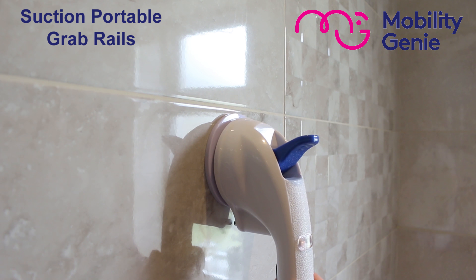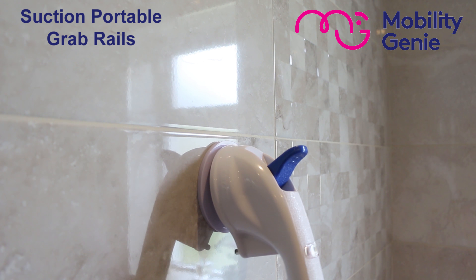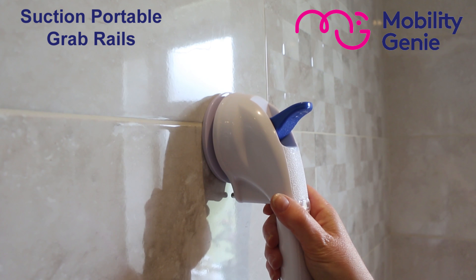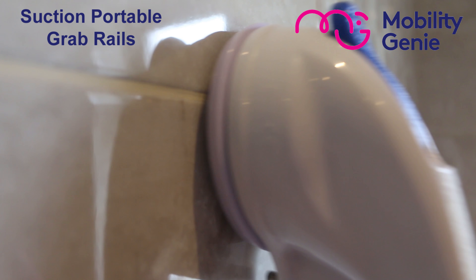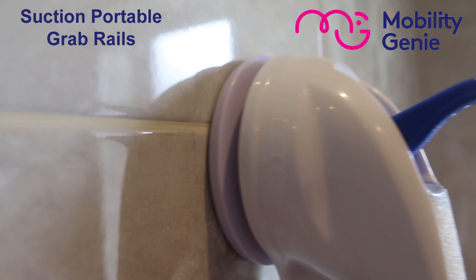There you have a sturdy and safe support without any screws, but you need to follow the instructions extremely carefully. And now we're going to demonstrate in the bathroom.